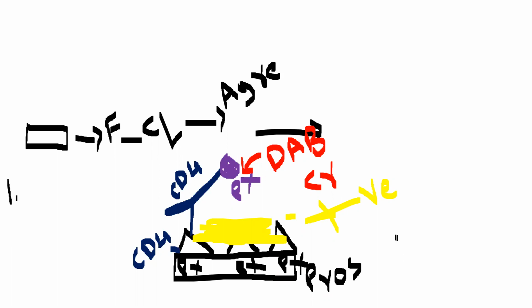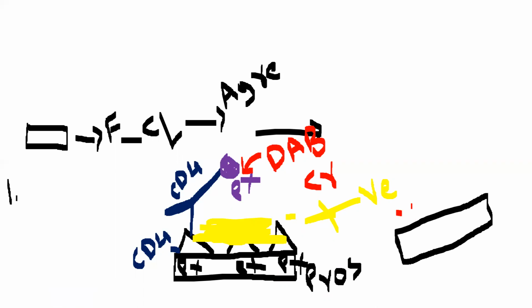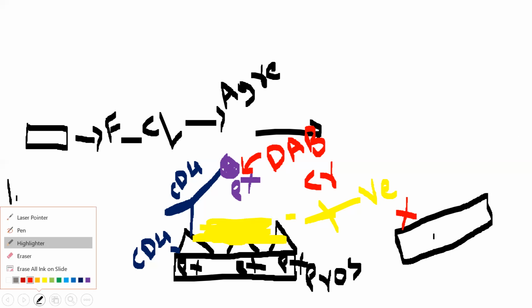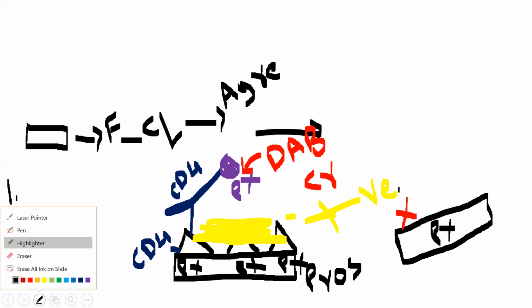Now let me show you one thing here. This tissue doesn't have the CD4 antigen. The tissue doesn't have the antigen, so I'm keeping red here. There is no antigen in this prostate tissue, but this prostate gland has peroxidase. So I will assume that, since there is no antigen, this is negative for this antigen. So I will first add primary antibodies. The antibody with peroxidase won't bind to the tissue.